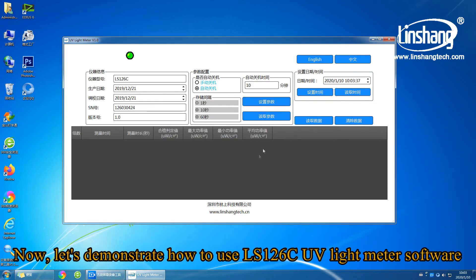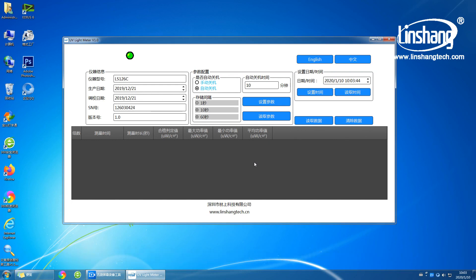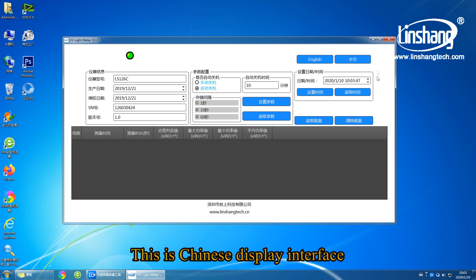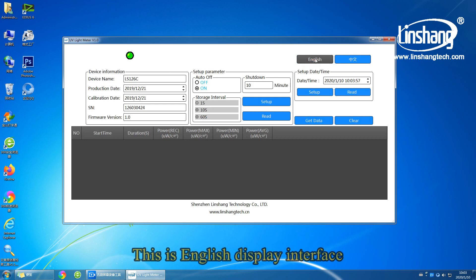Now let's demonstrate how to use LS126C UV light meter software. This is the software display interface. This is the Chinese display interface. This is the English display interface.